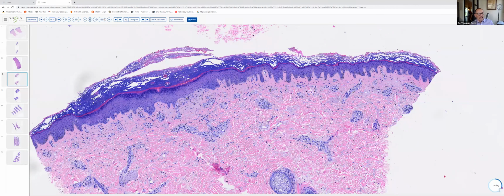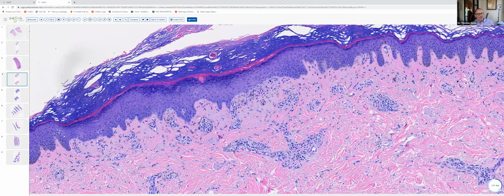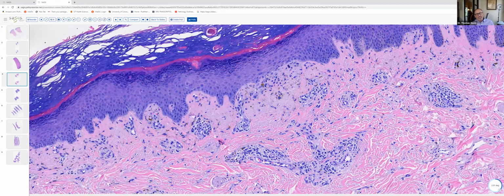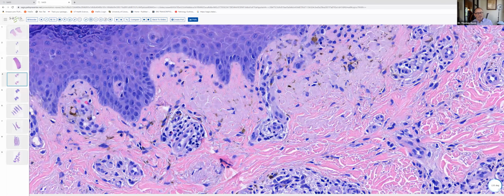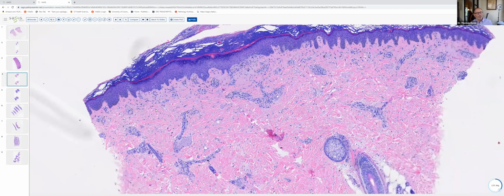But you can see that there is evidence of lichen simplex chronicus here. We've got hyperkeratosis, hypergranulosis, epidermal hyperplasia, and then this keratin-derived amyloid. And the amyloid, of course, can be stained. You really don't need to stain it. It's got a very distinctive appearance on H&E stained sections. But if you wanted to prove that it was amyloid, we could stain it with a Congo red stain or a crystal violet stain. And we can even use IHC stains, immunohistochemical stains directed against keratin, and that will also stain the amyloid deposits. So lichen amyloidosis, an example of a depositional disorder.